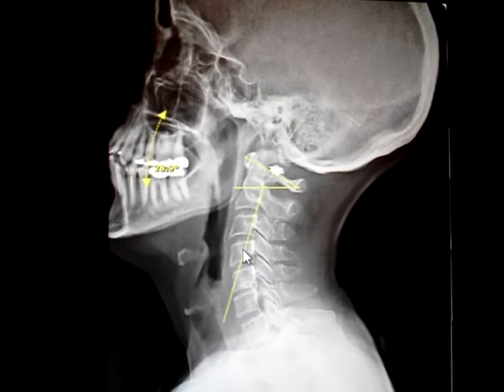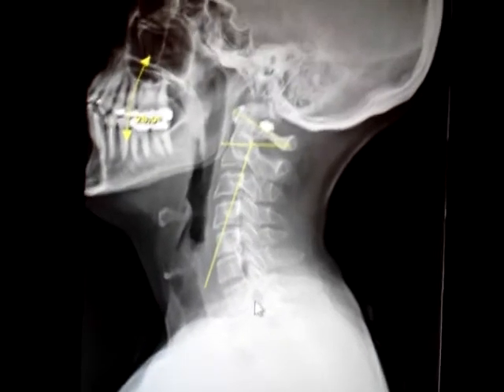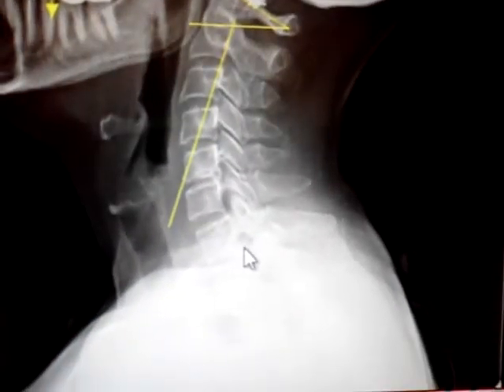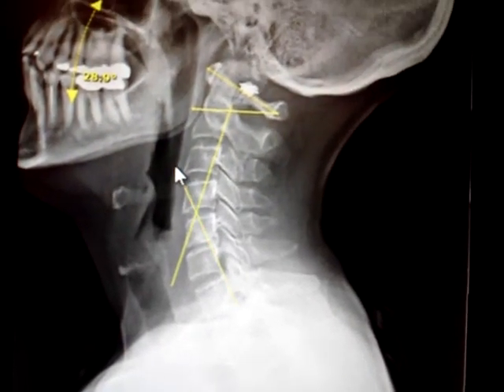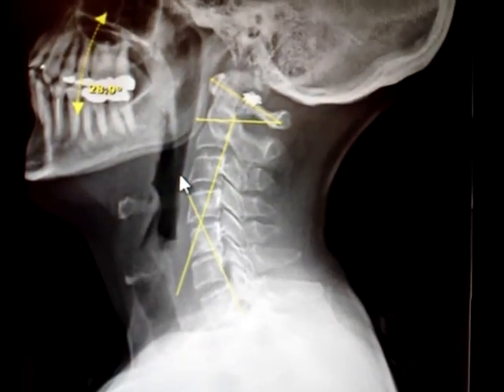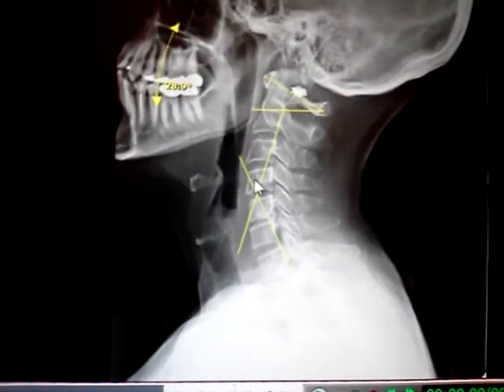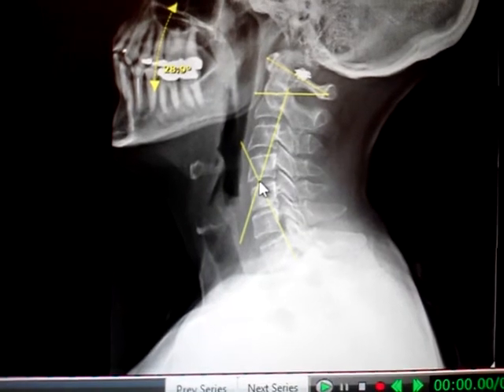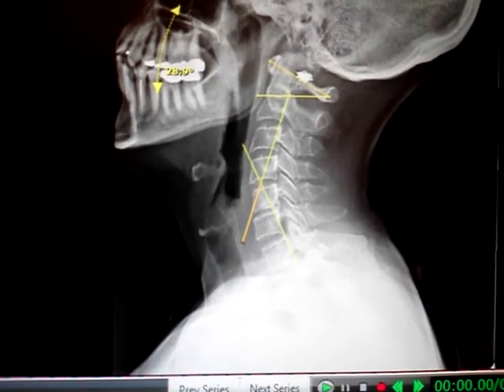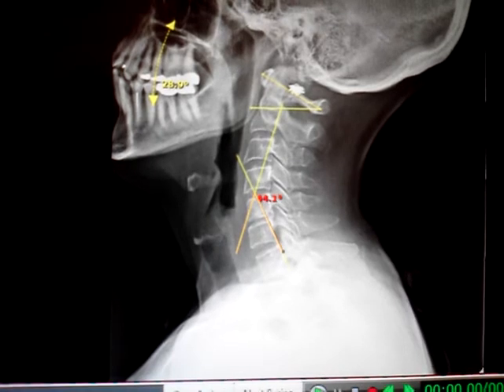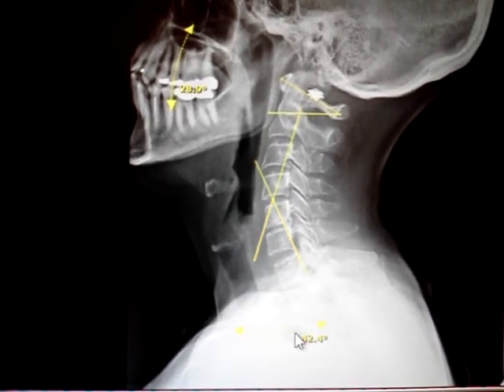This is C3, C4, C5, C6, and C7. Go down to the back of the bottom one, and you're going to extend this one up instead to intersect. Go back up to the angle tool we just had on the APL. Click where it intersects, go to the bottom left, go to the bottom right. If the lines just overlap and you don't see them, that's a 42-degree curve.